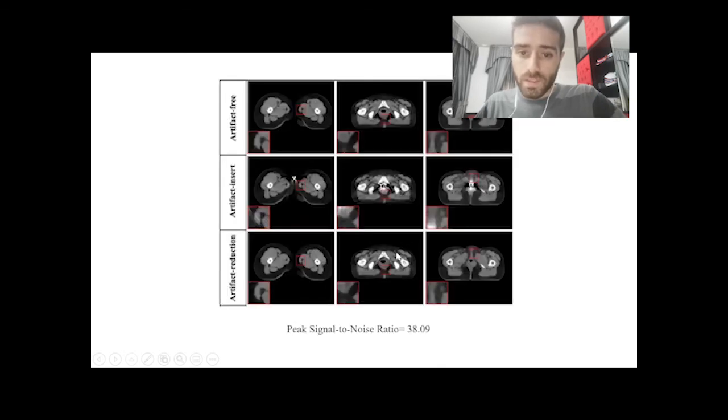The model was efficiently capable of reducing metal artifacts and improving the visualization with a high peak signal-to-noise ratio equal to 38. And this is clear in the cervical CT images below. However, the study was done for different slices at the same contrast. So different contrasts should be examined to confirm the validity of the trained model.